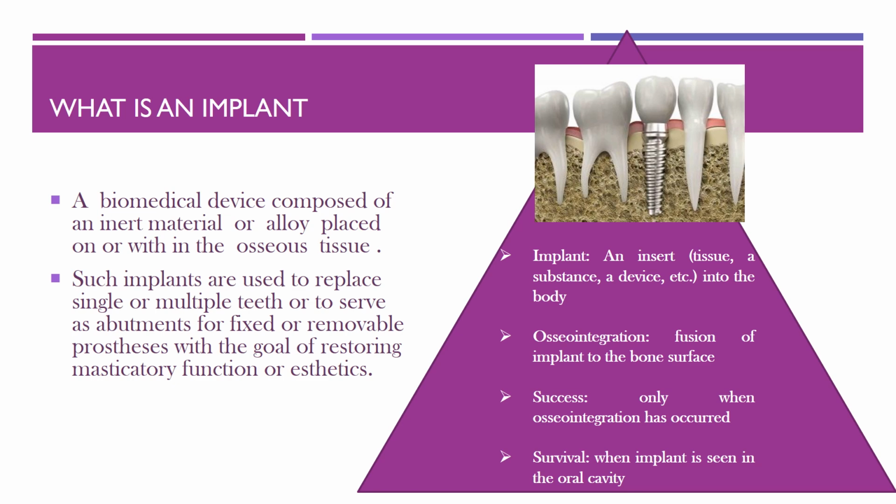So when we come to different terminologies, we have implant, that is inert material that is inserted into the body, and the fusion of implant to the bone surface is called osseointegration. And success is determined only when osseointegration has occurred, and survival is when the implant is seen in the oral cavity.